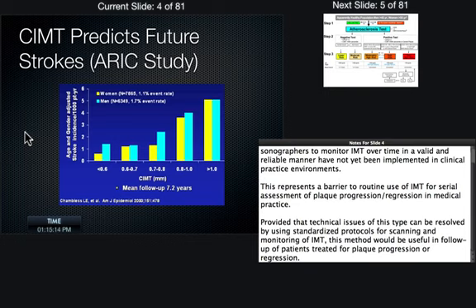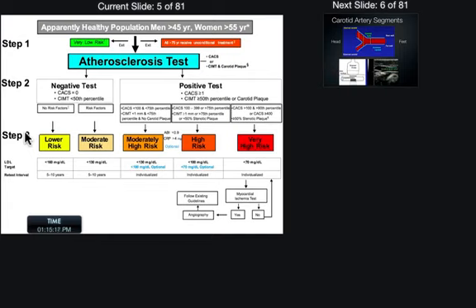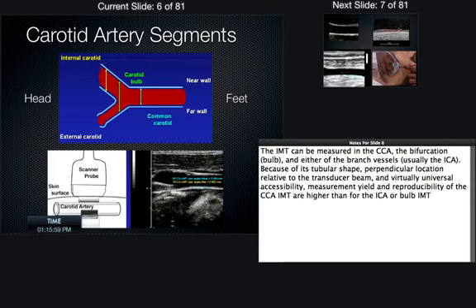So one group of folks looked at putting this into a really complicated algorithm, which I'm going to walk you through now, just kidding. But basically, this is the idea that here's your carotid intimal medial thickness in the percentile range here, less than 50th percentile, you can see, with some other scores, and your LDL target, and then what your retest interval is. And once you get above the 50th percentile for your CIMT thickness, there's this complicated algorithm that you could use. Obviously, we're not going to memorize this right now, but I just wanted to let you know that you may find some utility for this, especially if you're entering primary care or cardiology.